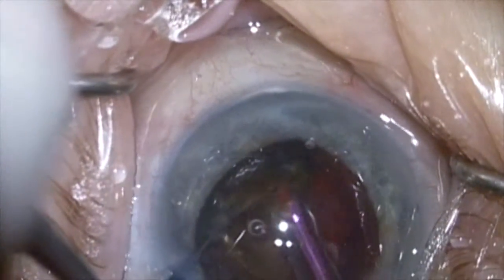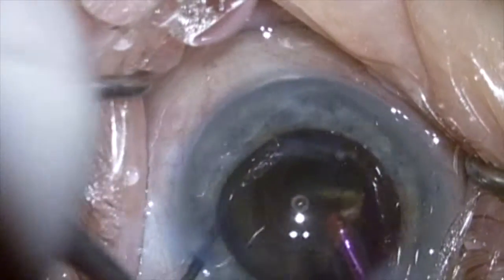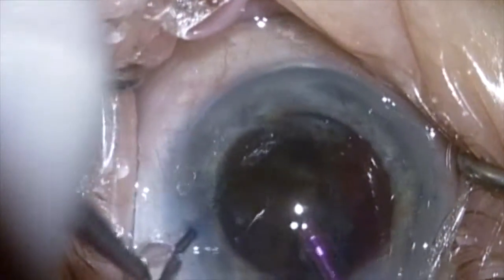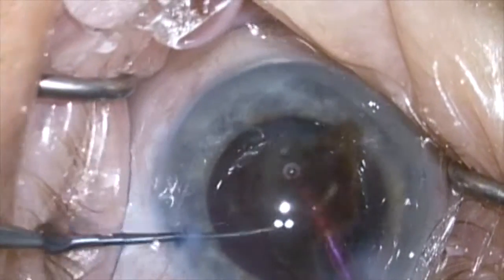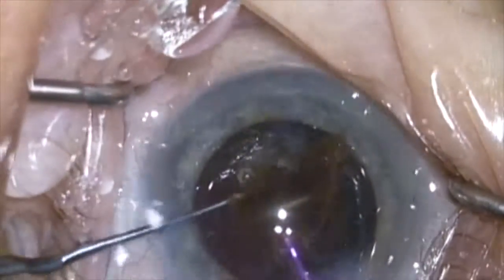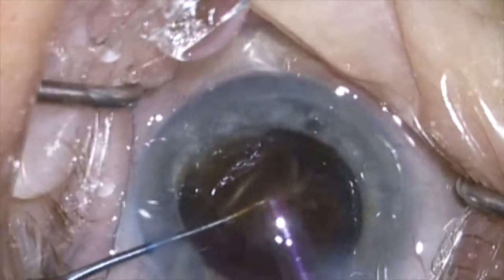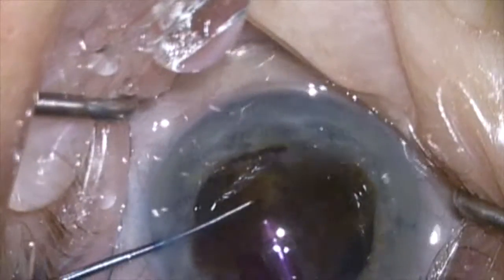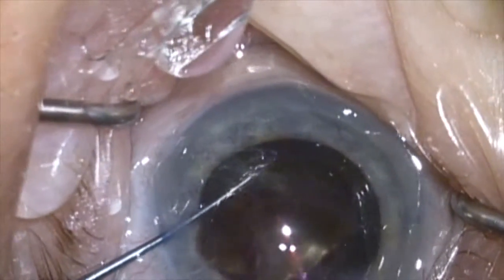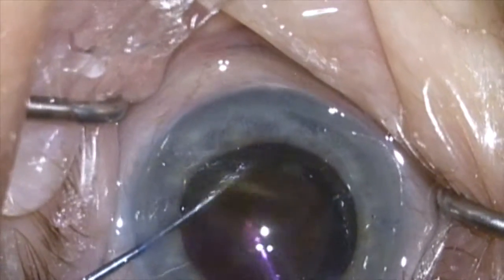This is the last piece of the first half of the lens and I have plenty of room to work within the capsular bag. I'm not really putting any stress on the zonules here, and I have dispersive viscoelastic protecting the cornea endothelium, so I'm in a pretty safe zone. I'm also keeping an eye out for any loose chips or pieces to make sure they don't sneak under the iris and get left behind.